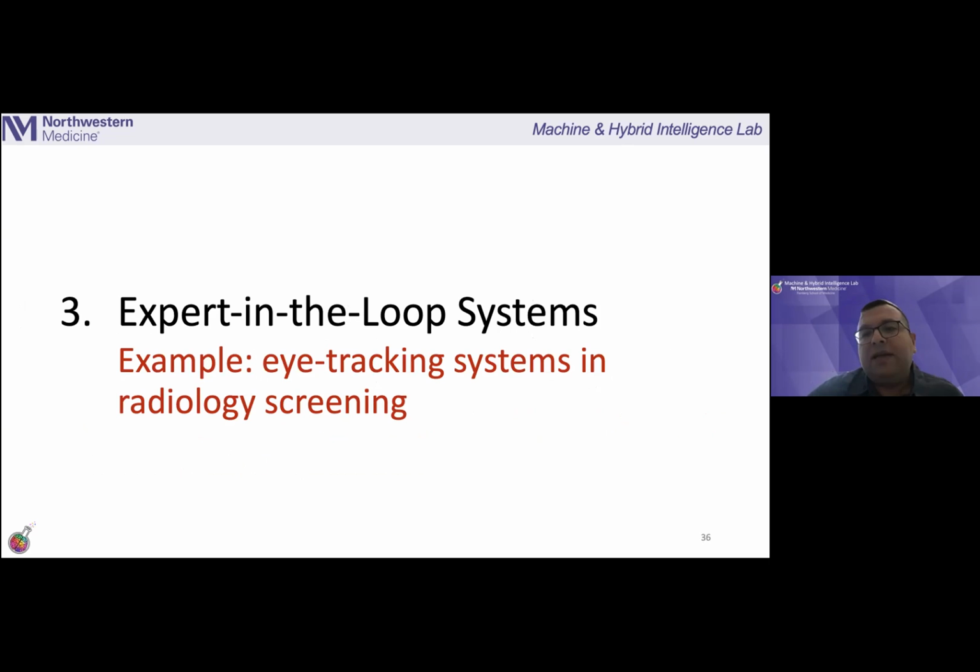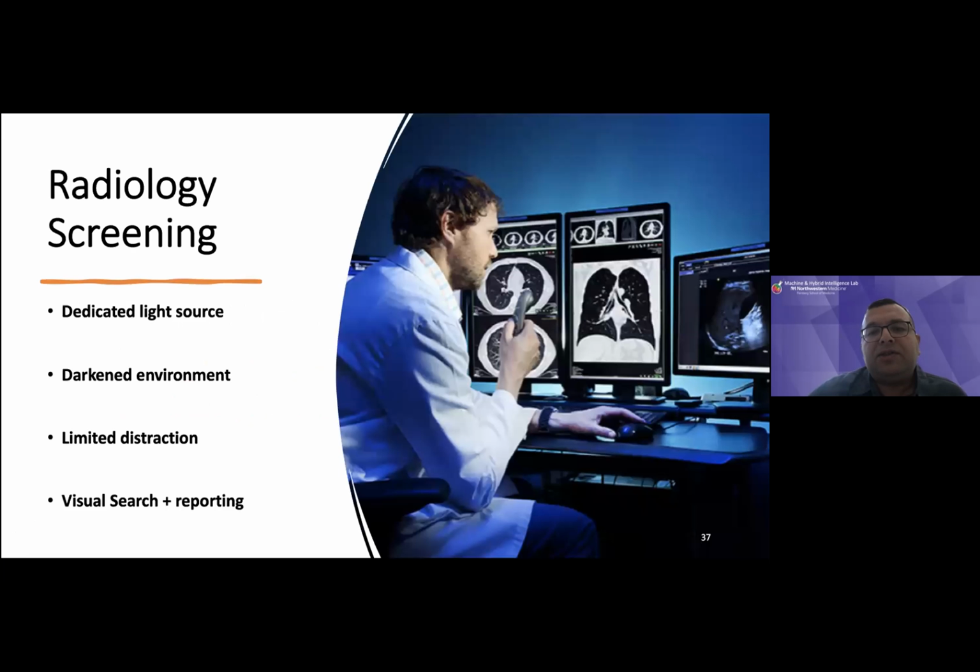As I said, we are using eye tracking systems in the radiology rooms in real settings, trying not to disturb the radiologist in the setting. Many of those eye tracking systems in the past, and when we also started, started in the laboratory environment with a lot of constraints, and in 2D, and the radiologists or your experimenters are affected under these settings, and lots of constraints.